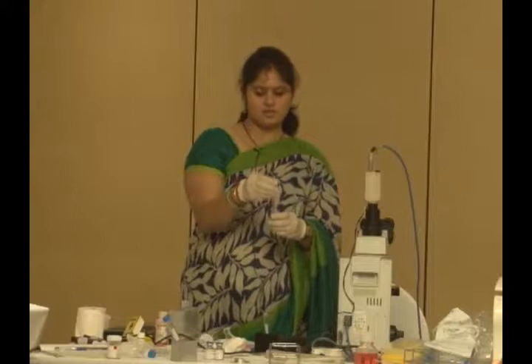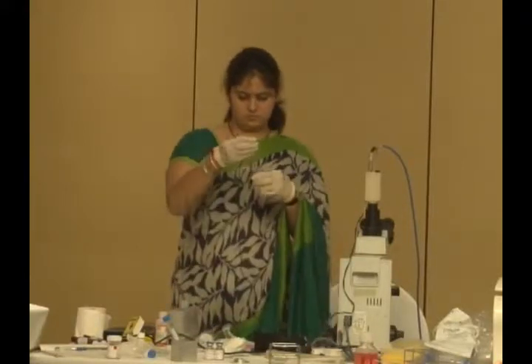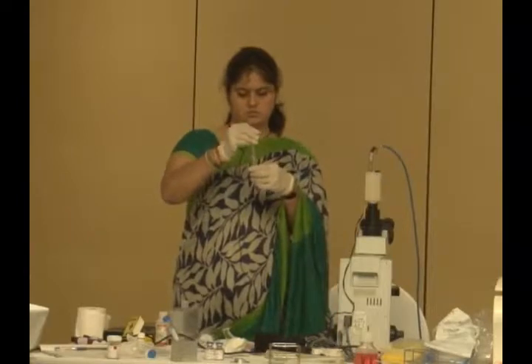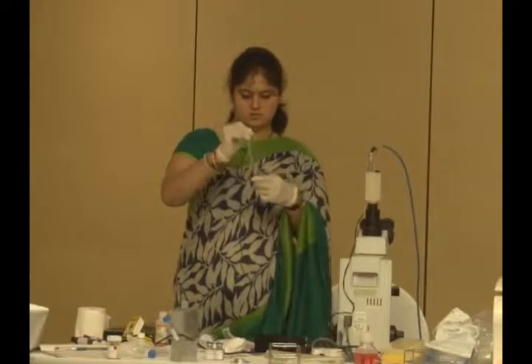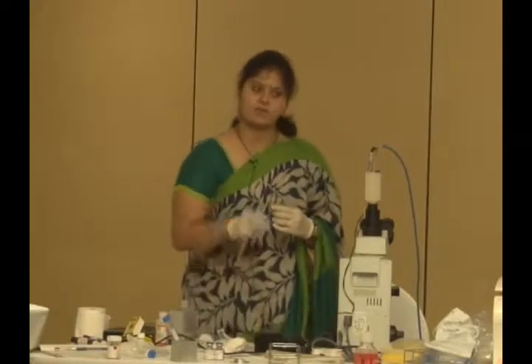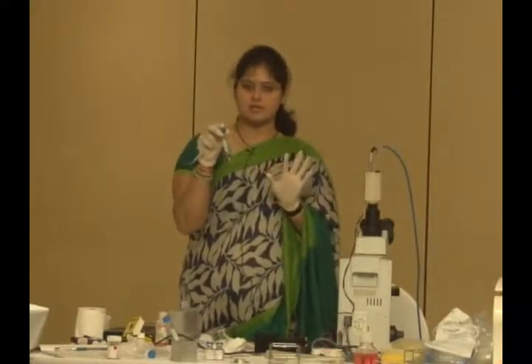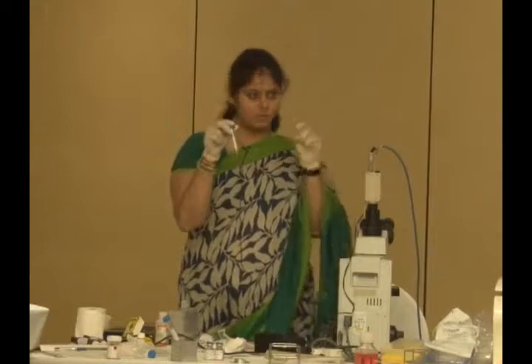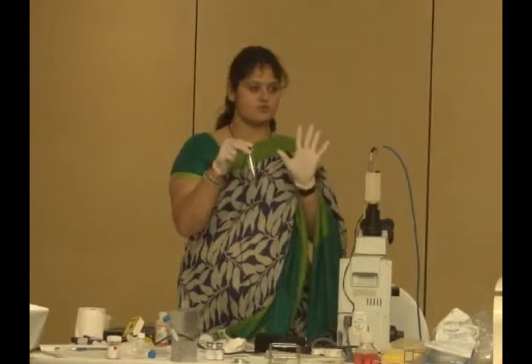Here we are not using silica particles, so you can take 2 ml of the medium. Mix it well and centrifuge this for 10 minutes at 1500 rpm. We will give only one wash because we are not using silica particle here. We just concentrate everything at the bottom, so we have a good concentration of the sperm.